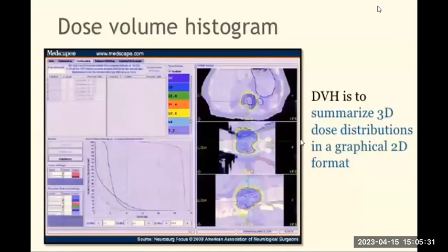Now you can easily understand the dose distribution from that. The depth is unknown, which is a very difficult and complex task. But you can approximate the depth, and by continuous study of the MRI and CT images, the oncologists can come to a conclusion that the depth is this much and this much dose is required. That is what you call the dose volume histogram.